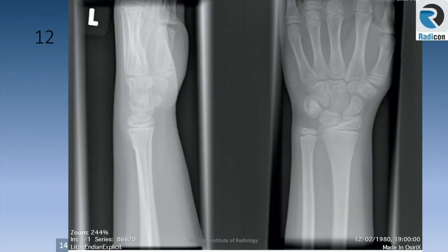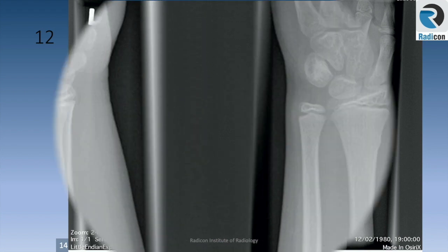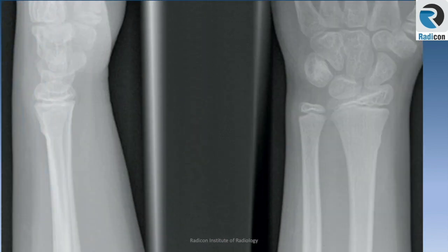Case 12 is a wrist film in a child. There is an easy finding: buckle fracture of the distal radius. Please remember, do not ever call a buckle fracture in adults and a mature skeleton. You will be penalized for that in the exam.